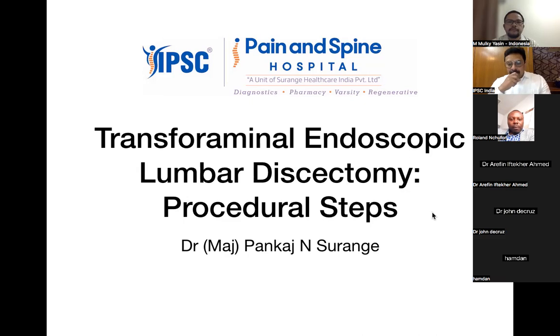Okay. All right, guys. So if you remember, we discussed the anatomy of the spine. We discussed the multiple tissues which we cross to reach our target, that is the foramen, and how to reach the disc. We discussed what important structures are there in between, and what structures we should avoid going into, like the peritoneal area and other vascular areas, and what painful areas are there when we reach our target, what painful tissues we have to anesthetize so that we can have a very good procedure only under local anesthesia.